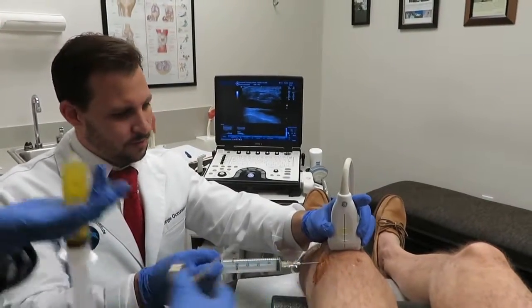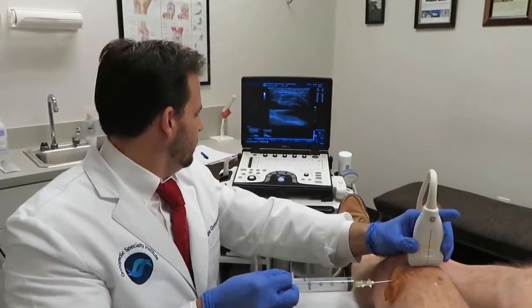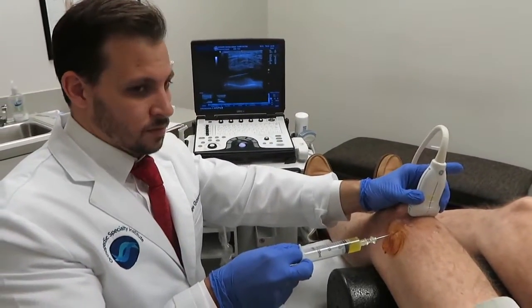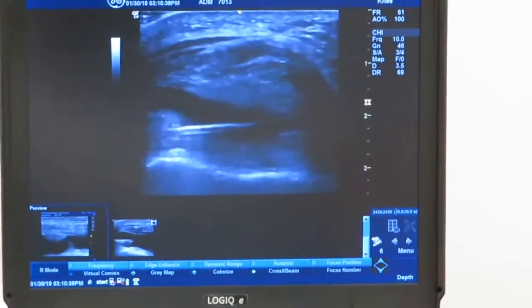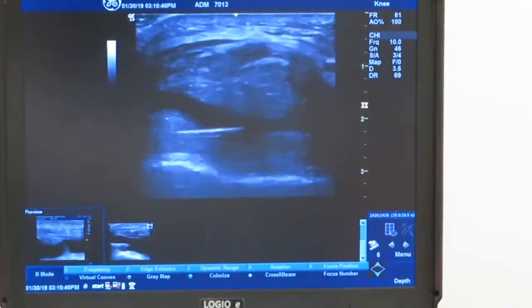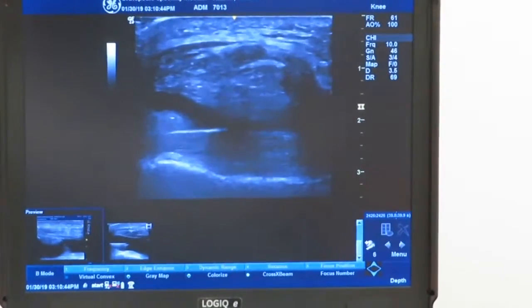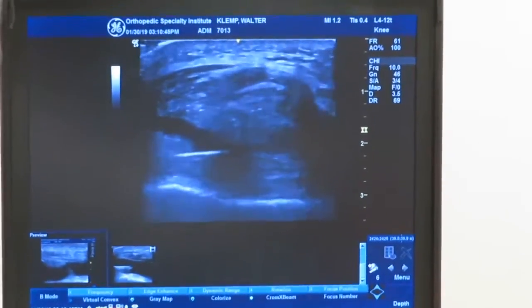I'm not poking right there. How are you feeling? Good. Look at that — my God, I can't believe how much is in there. I'm actually in my needle. See how it's collapsing now? It's even getting smaller and smaller. The cavity is getting smaller. And I'm still making sure that I don't move it around and I stay inside the pocket.